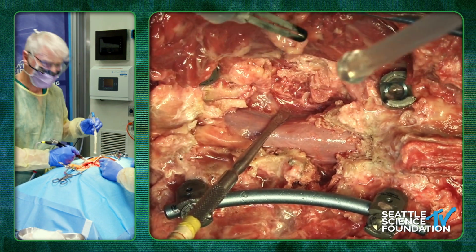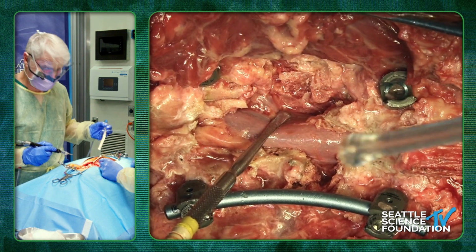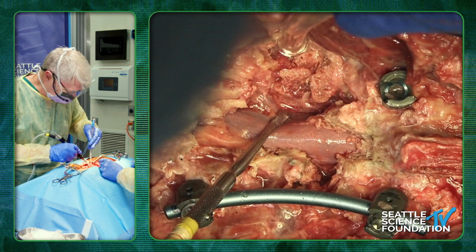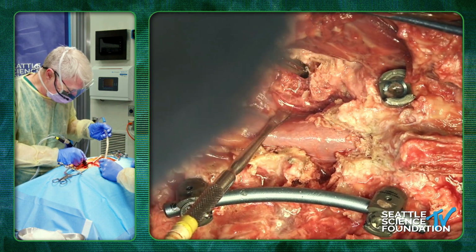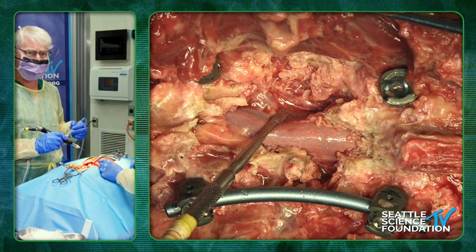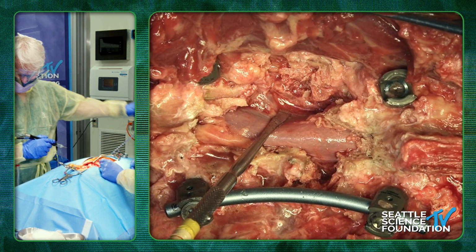And Stephen, do you protect the front of the spinal column? Do you put spoons around? Yeah, we designed those spoon retractors. In the lumbar here, I don't have to worry about it so quickly because I'm not going to go all the way through on this kind of osteotomy. On the thoracic, I definitely always, the first step we do is to put those spoon retractors right across.